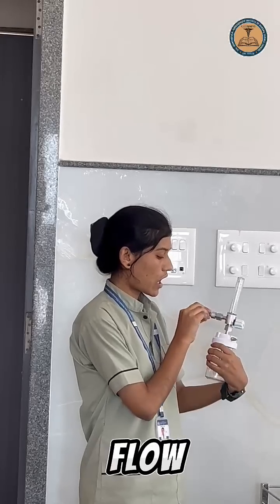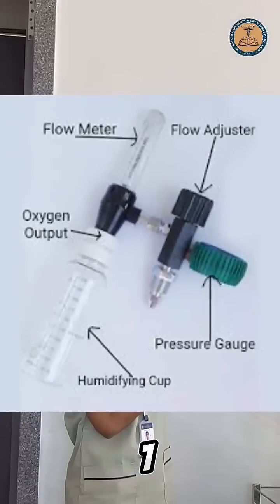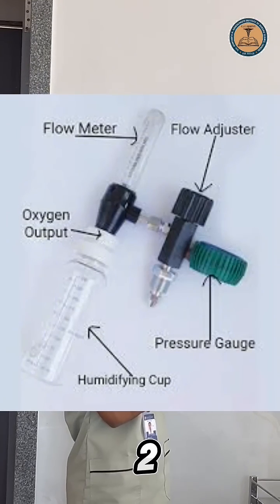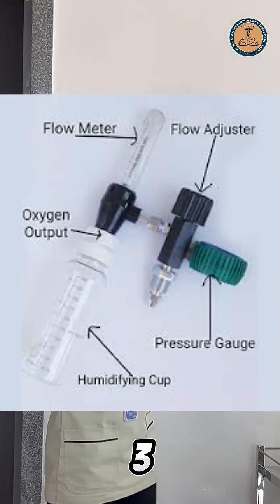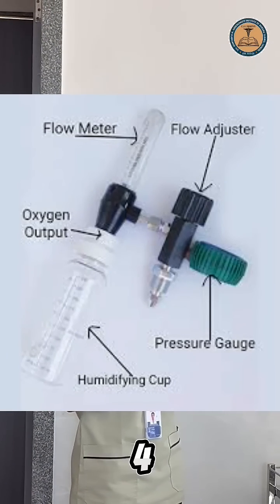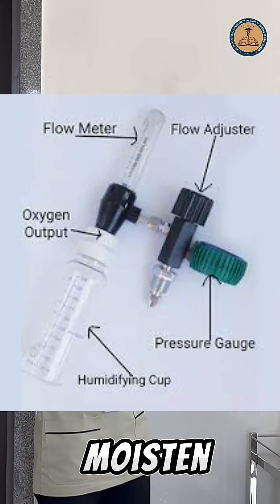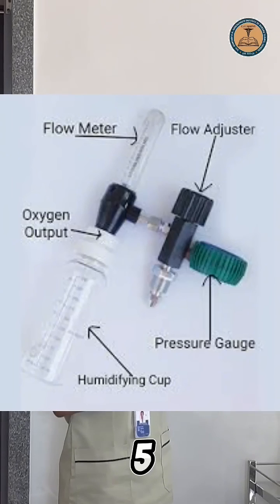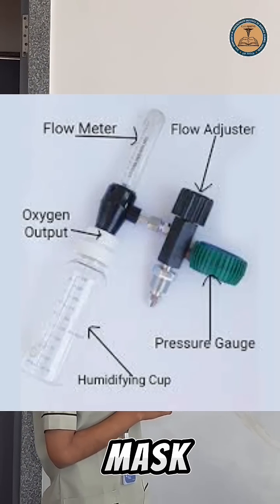Parts of the oxygen flow meter. The main parts of an oxygen flow meter are: 1. Flow regulator knob. 2. Glass or plastic tube with LPM markings. 3. Ball or bobbin that shows flow rate. 4. Humidifier bottle, optional, to moisten dry oxygen. 5. Outlet connector, attached to nasal cannula or mask.